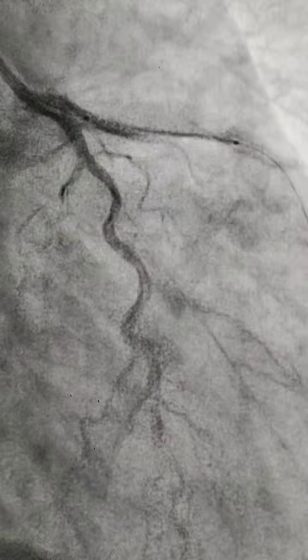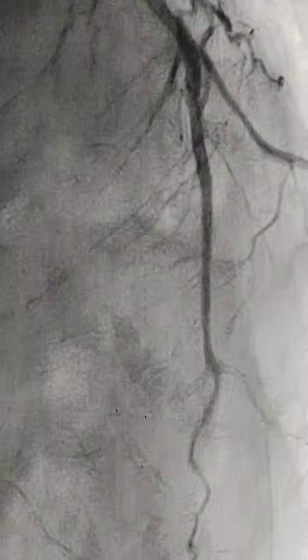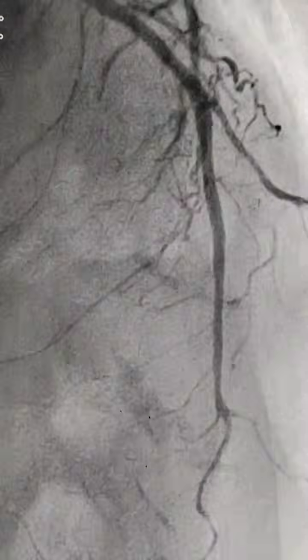The stent was 3x28. I was in doubt whether such a long stent will go or not. But it went, and deployed at around 14 atmospheric pressure. RBP was 16. The length of the stent is 28 and diameter 3. Then again I inflated the stent at higher pressure 16, and this is the scene after stent deployment.